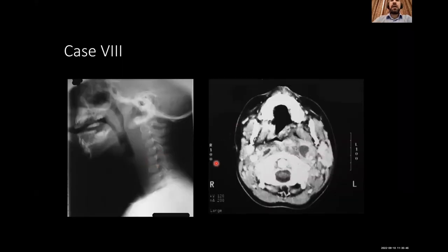And here is a very important case. I wish I could hide this side. So what is the problem now?